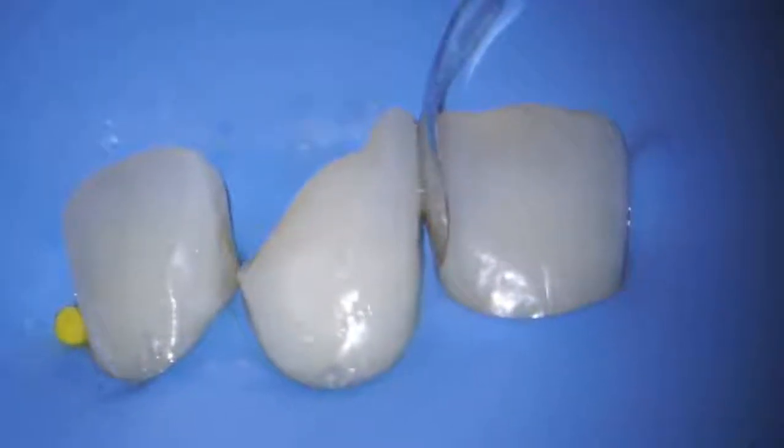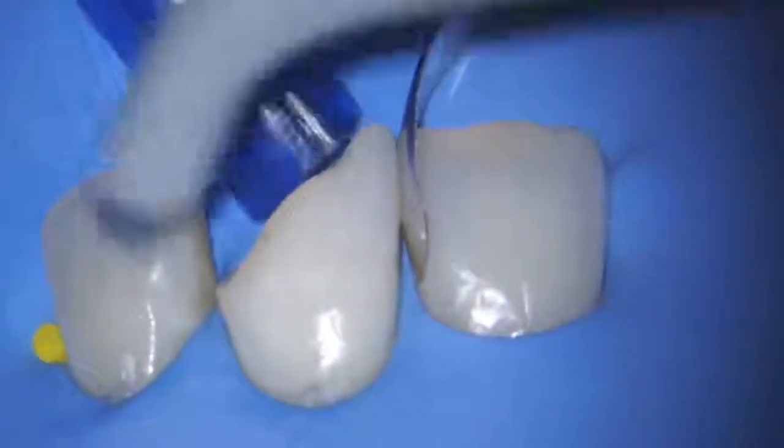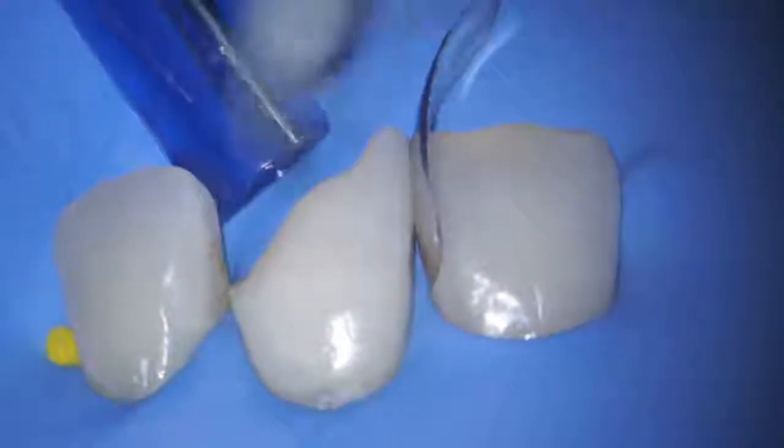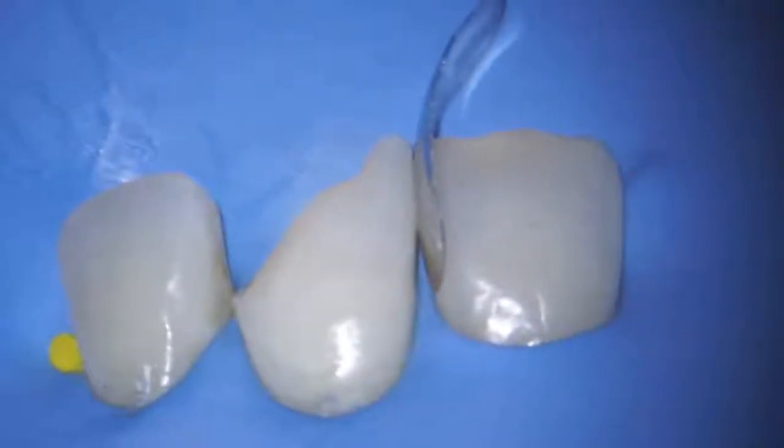Thorough drying of the surface with a powerful flow of clean air. And only then I apply hydrophobic filled resin, or just the second bottle from OptiBond FL.